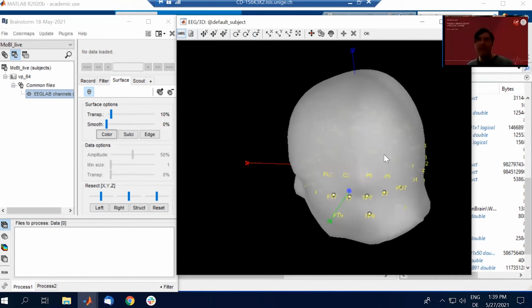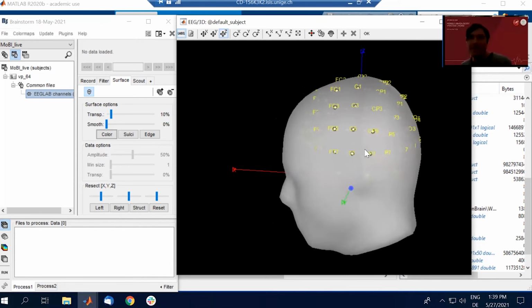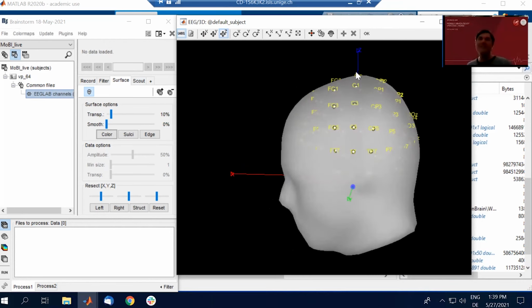And then we know, okay, it's already too low for sure. So we can shift. We can click on this panel here and shift it upwards. I do that with my right mouse, shift it up. And now this is where the guessing starts. That's somehow an undefined part. If you have a picture or some idea where the electrodes were in your subject, it's already good. But here we have to guess because it's both default anatomy and default channel locations. That's why we have to do some kind of qualified guess, let's say. So already it's high enough, but we have to stretch and bend them.